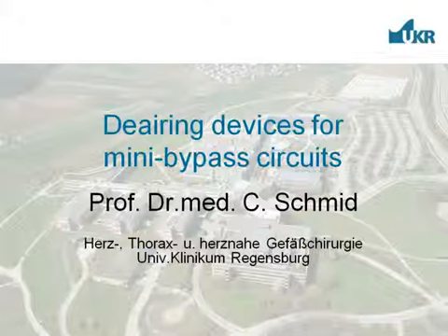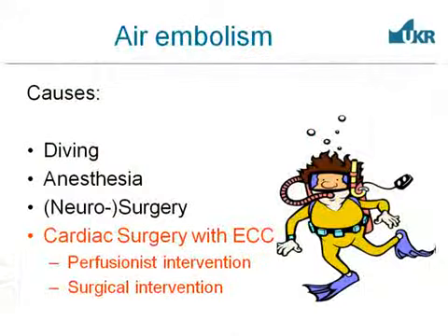I was asked to give a presentation about the deairing devices in mini bypass circuits, and I found out that it's a real difficult task. Anyway, you have seen in the former presentation this morning that air, emboli, bubbles, microbubbles, mini bubbles are a real problem in many regards. We all know these problems from diving with Caisson's disease, from anesthesia, neurosurgery, and of course in cardiac surgery, where air can enter the circuits from the perfusionist side, but also from the surgeon side.